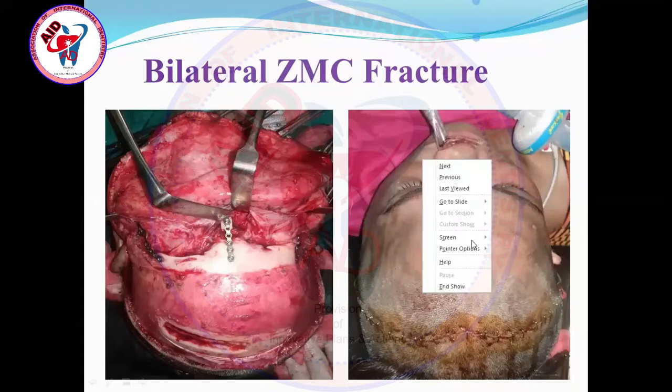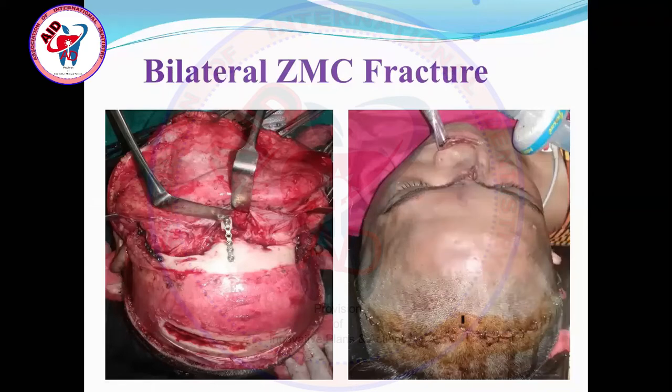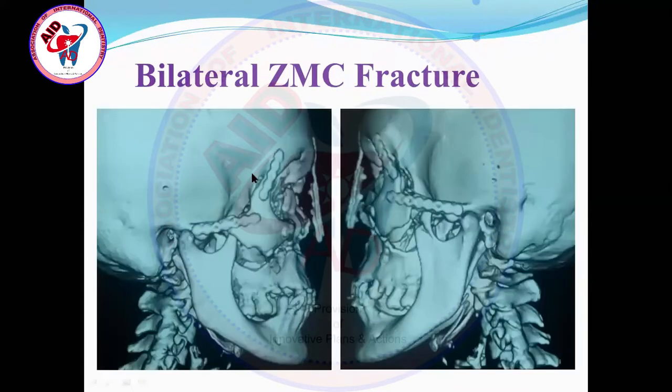And this is the mid cone area or tip area, which guides you that this is the midpoint of the suture. This is the post-op CT scan of the same patient. Now look here, the zygomatic bones which were grossly displaced downward, now these are properly positioned. And the bone is approximating, properly reduced with the frontal bone and fixed with the plate.